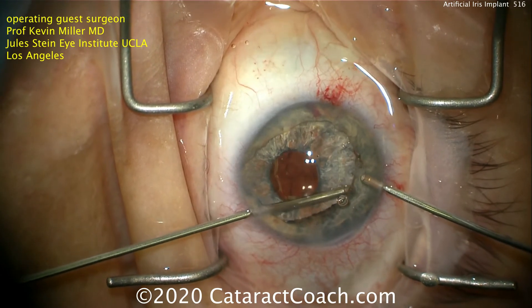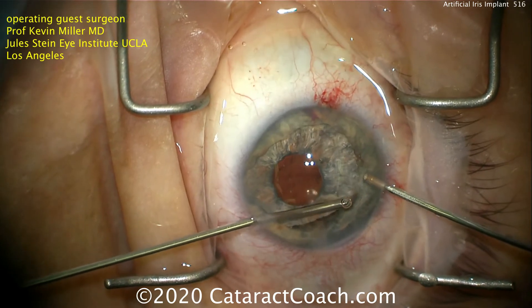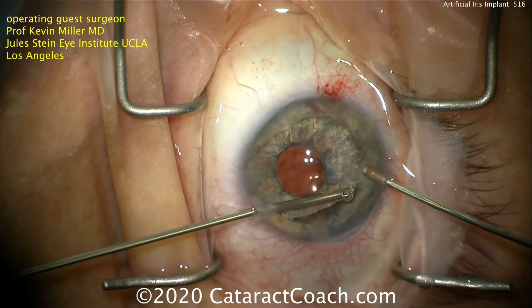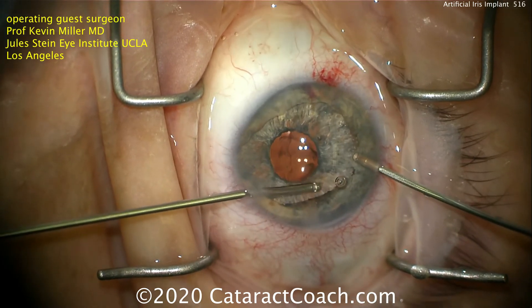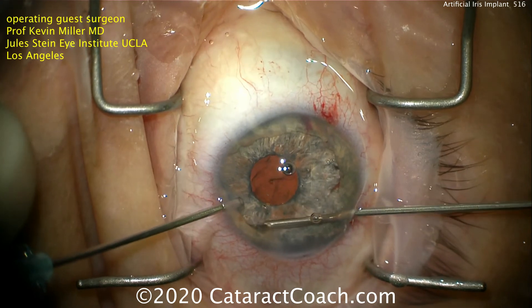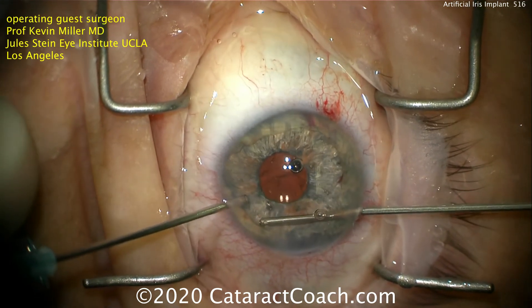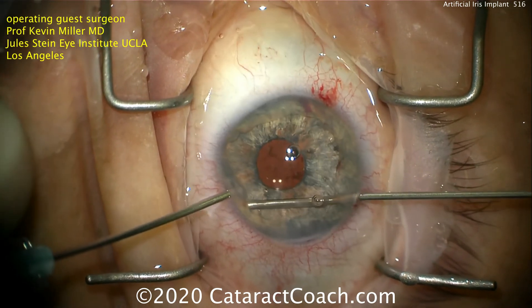And the result's going to be very natural. You can see about half of it's done so far and it looks just great. I asked Dr. Miller about bleeding in these eyes, but he says because the iris is already damaged and atrophic, these tend to be ischemic tissues that don't really bleed much. There can be a little bit, as you see there, but it's usually not a significant concern.